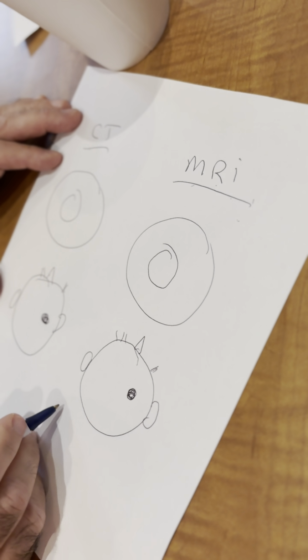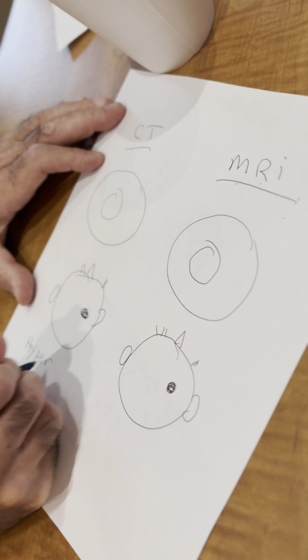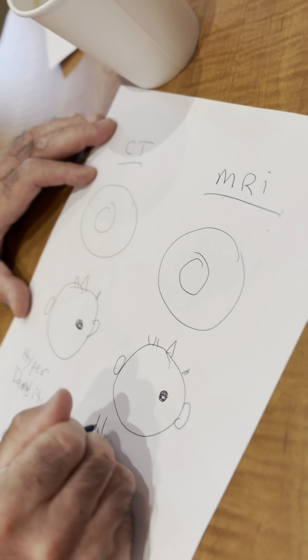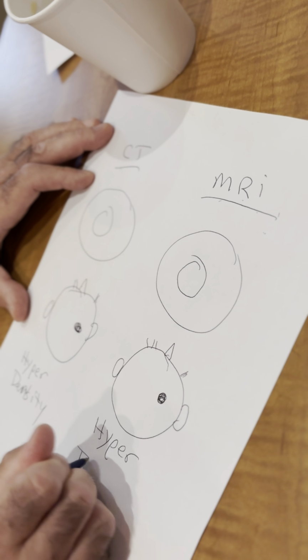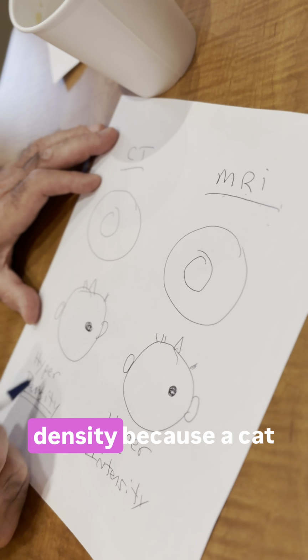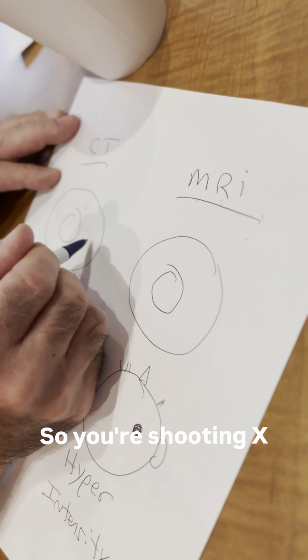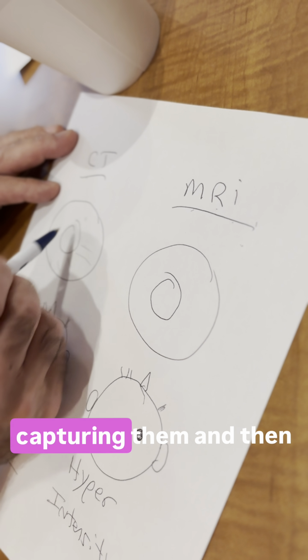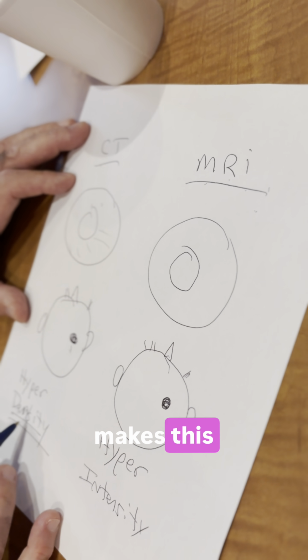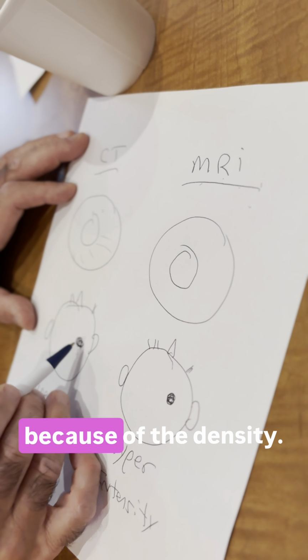All right. So in the CAT scan, you'll refer to this as a hyperdensity. On the MRI, you will refer to this as a hyperintensity, right? The reason it's a density is because a CAT scan is really a computer tomogram. You're shooting X-rays into the brain and capturing them and then recreating them into a 3D image. That's what makes this a density. Calcification will be bright, blood will be bright because of the density.